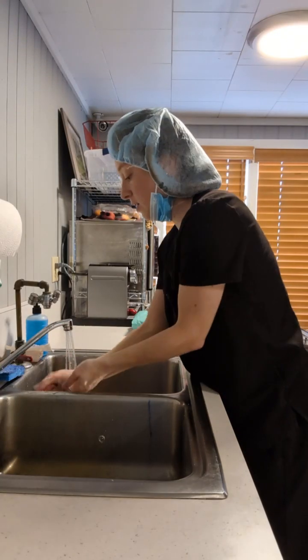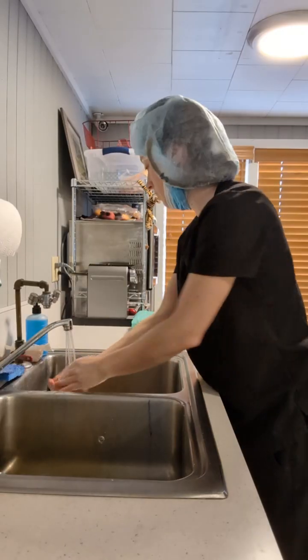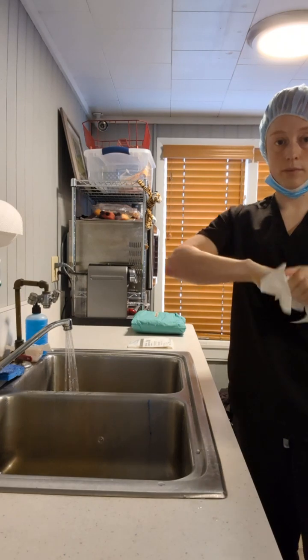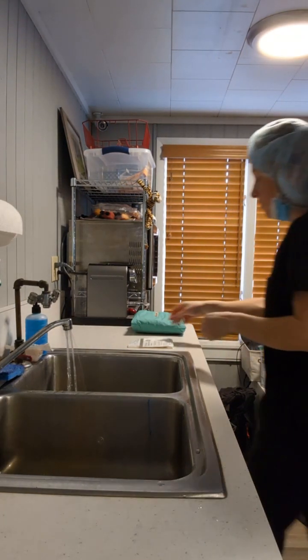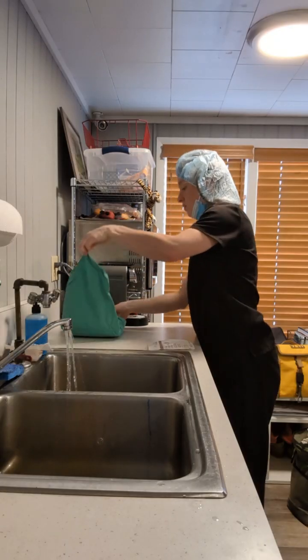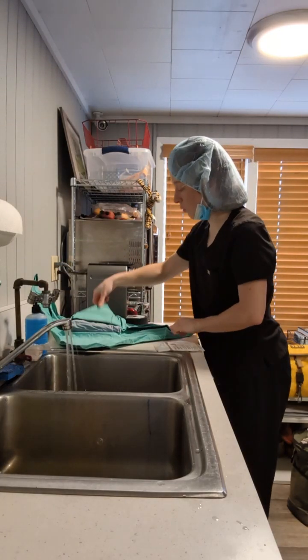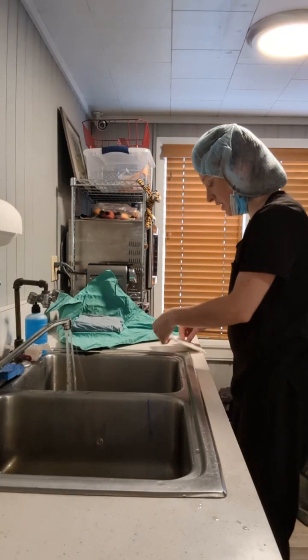Okay, so to do a surgical scrub, I just want to wash my hands first, make sure that they're clean. And I want to prepare the gown, just pulling on the corners of the outside drape without touching any of the inside contents.